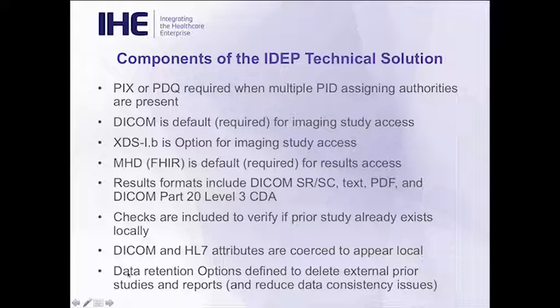And then finally, we decided that we will define named options for data retention to determine whether or not external prior studies and reports can and should be automatically deleted. And that, again, is defined as a named option because there'll be certain jurisdictions where if you use a report or a study for legal interpretation, you can't delete it.